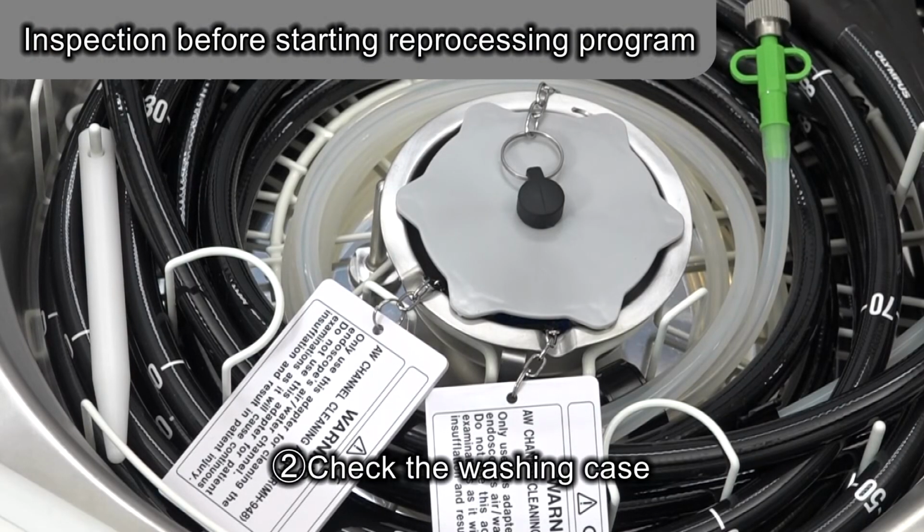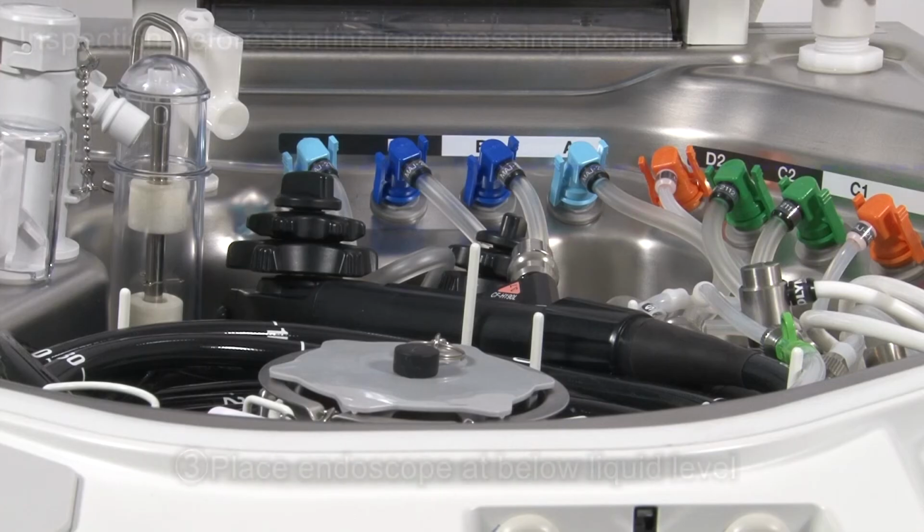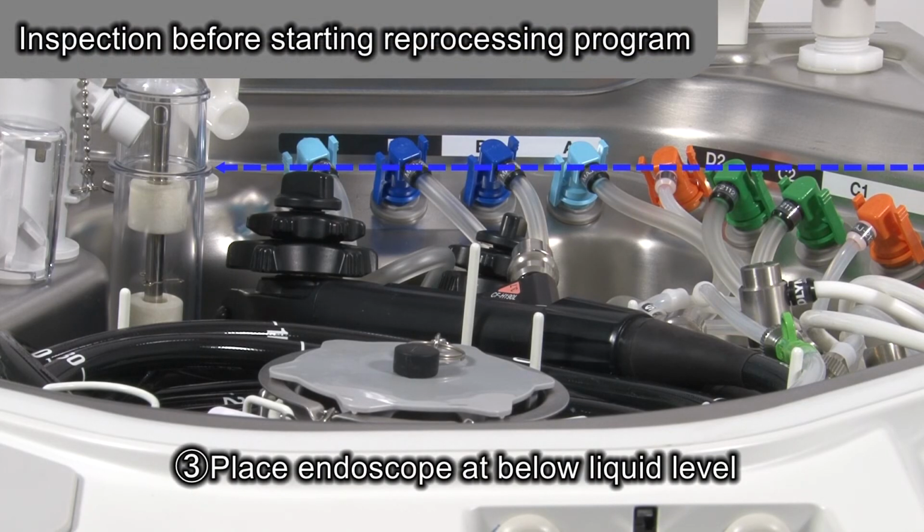Check that the cover of the washing case is closed and that the washing case is placed inside the retaining rack. Also check that the chains of the AW channel cleaning adapter are not piled up and the indication plate of the cleaning adapters are placed between the hooks. Always place all accessories only in the washing case. Make sure that the highest point of the endoscope is located lower than the index line height.